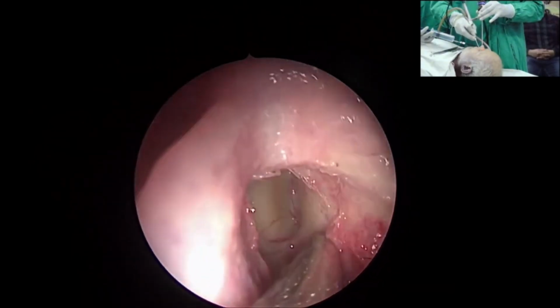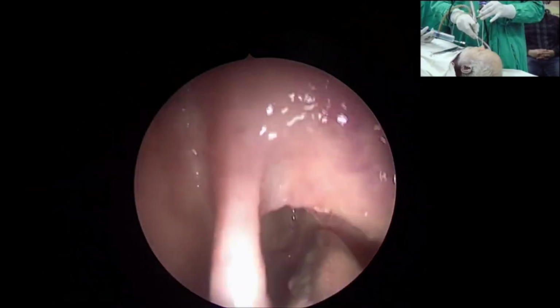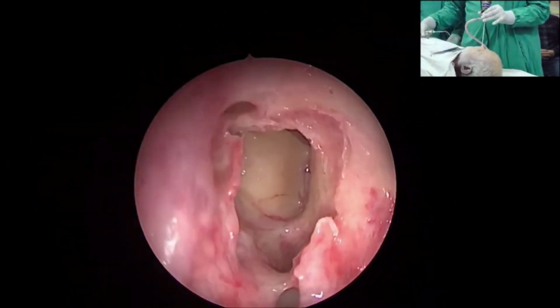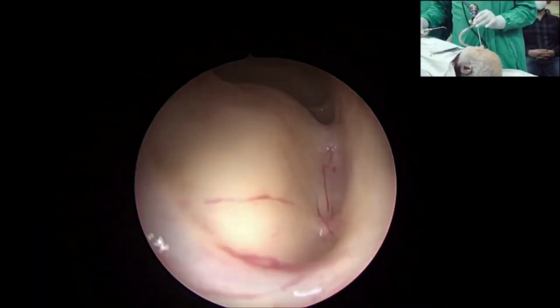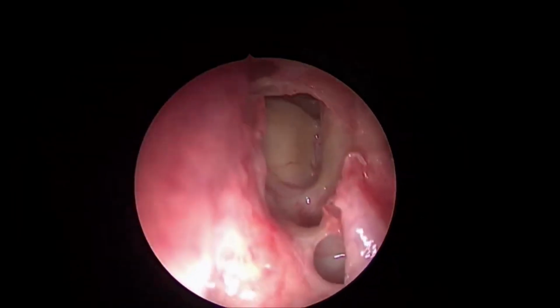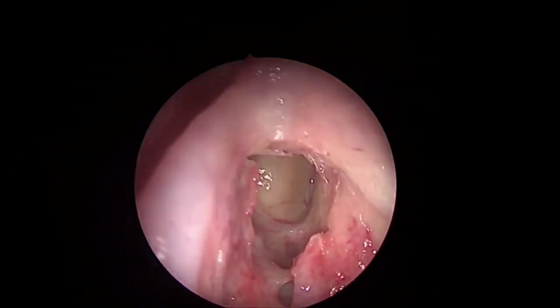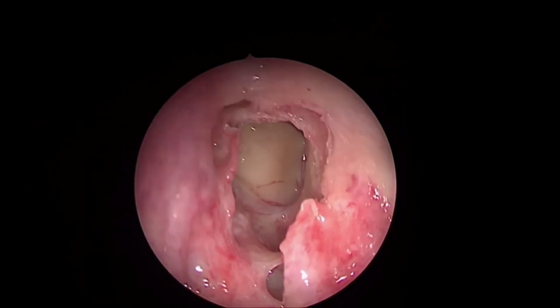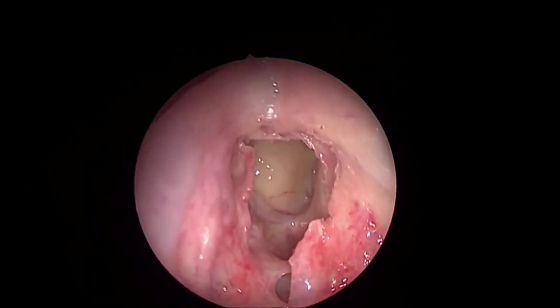See now, yes, I've removed this agger nasi and flushed with the lamina papyracea again. See this? And this has opened the frontal sinus pathway. Now, any cells lying anterior to the frontal recess are to be addressed like this. Go behind and fracture them out.